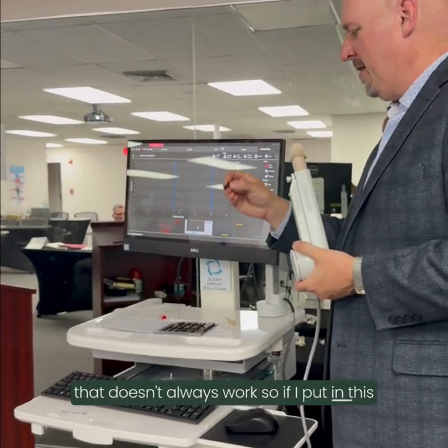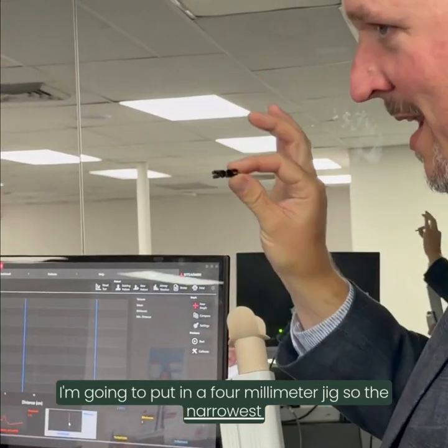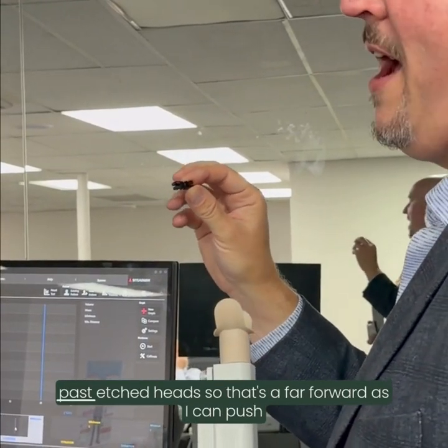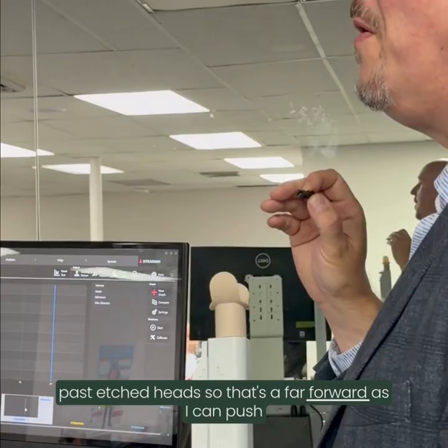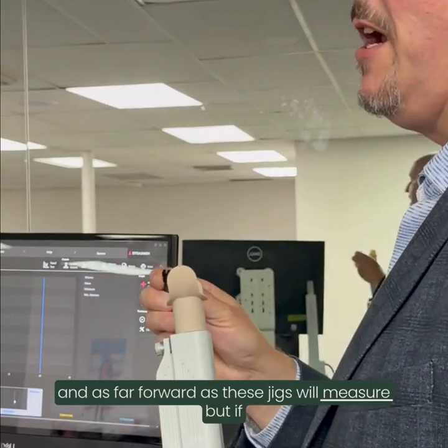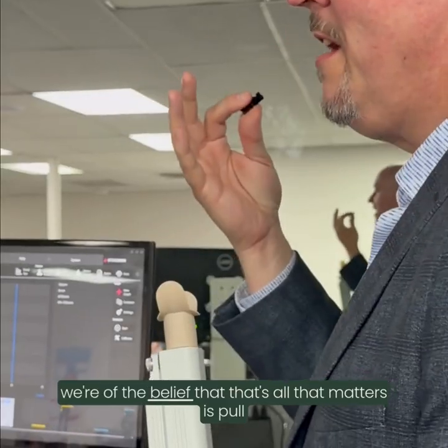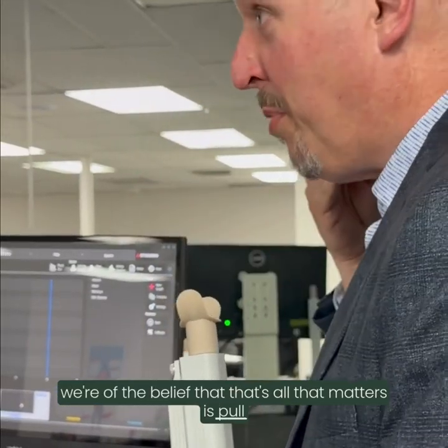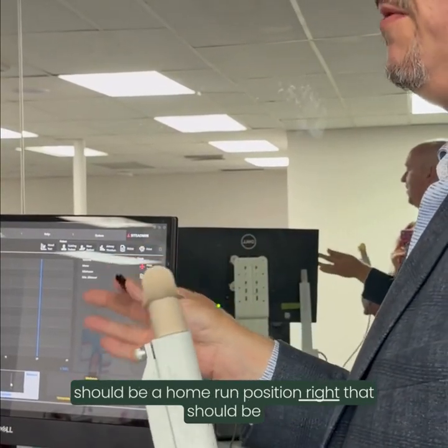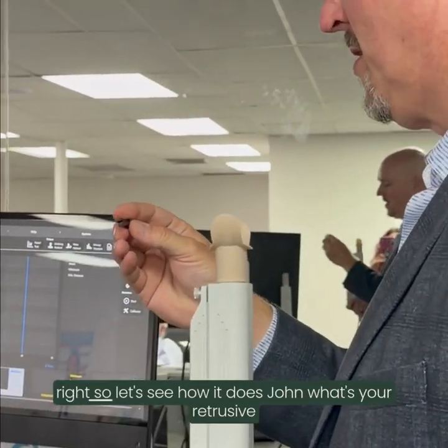So this is a good example. I'm going to put in a 4mm jig, the narrowest vertical we have, and I'm going to go 7 protrusive past edge to edge. So that's as far forward as I can push, and as far forward as these jigs will measure. If we're of the belief that all that matters is pulling them as far forward as you can, that should be a home run position, right? That should be the slam dunk, hey, your airway is popping, right? So let's see how it does.